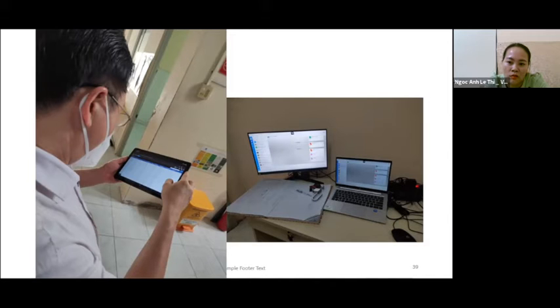People from the active finding will send the image of any abnormal chest X-ray film to an app, with this Zalo here, to the doctor, and he can review the film and decide whether we can refer this patient for further testing for TB diagnosis. Next, please.